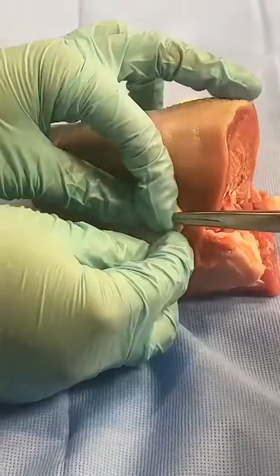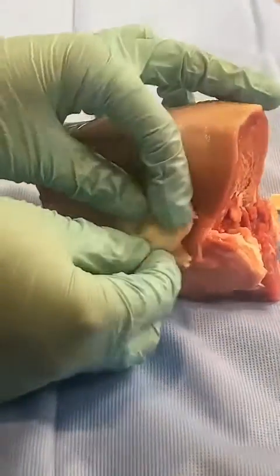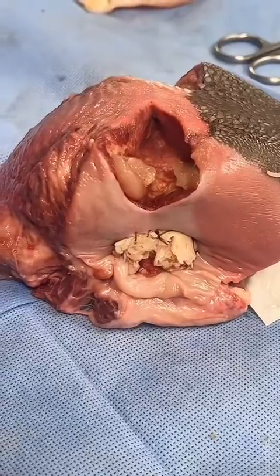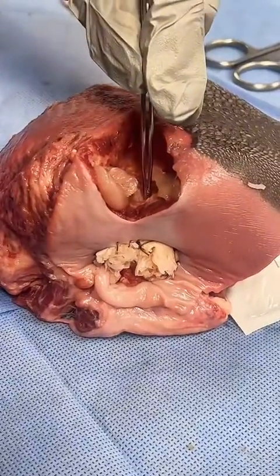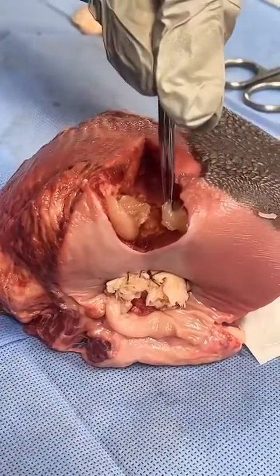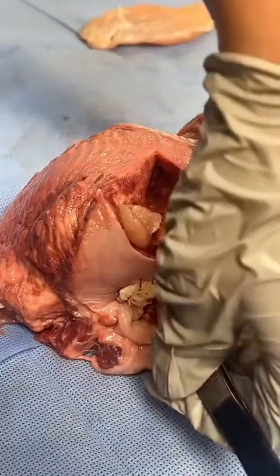They're going to sew this off to the sides to make the rectal mucosa. This area will be the perineum, and that's going to be the rectum. Here in the finished product: this represents the vaginal vault, this is the internal sphincter back here, and this is the external anal sphincter.